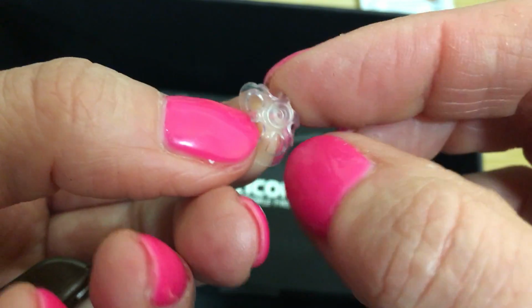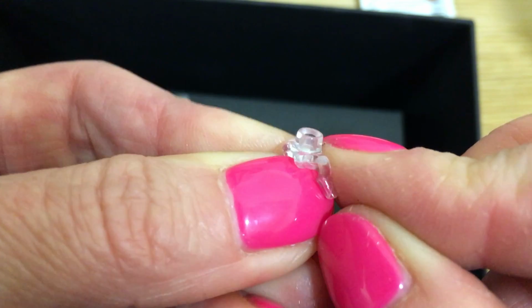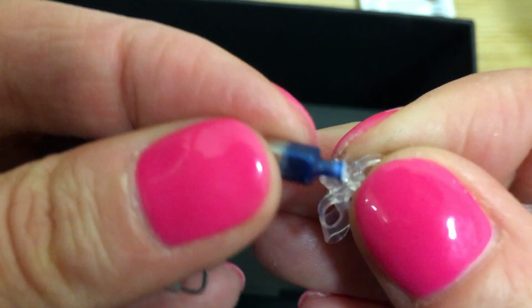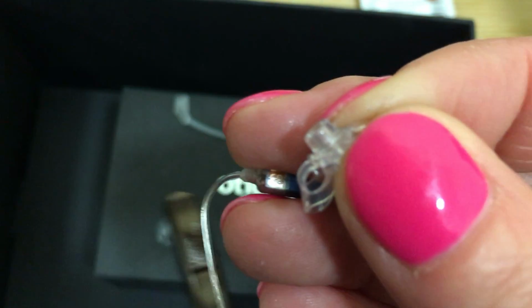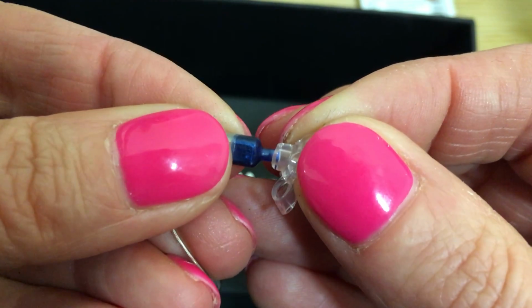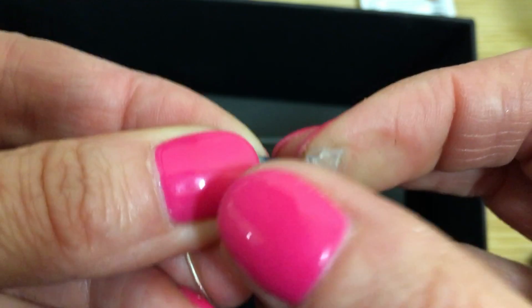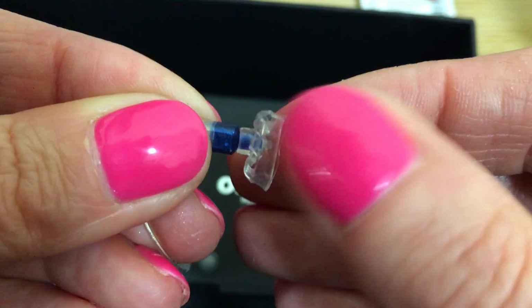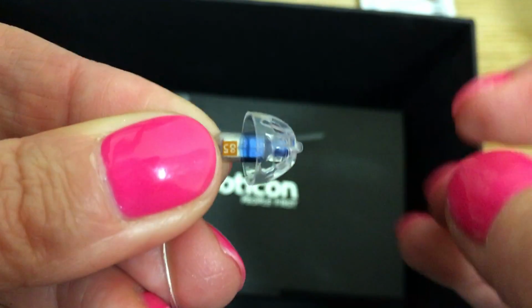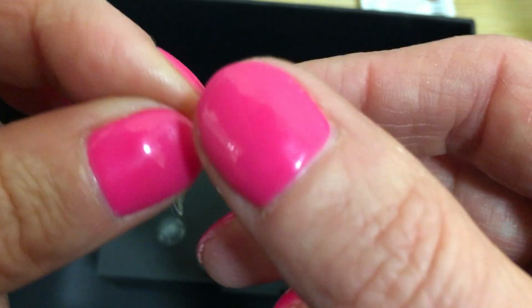Under the dome we have the little area of rubber which fits over the end of the speaker. So when we insert this, we must always make sure that the little sleeve fits neatly over the end of the speaker or the receiver, and that will ensure that the dome does not come off in the ear canal.